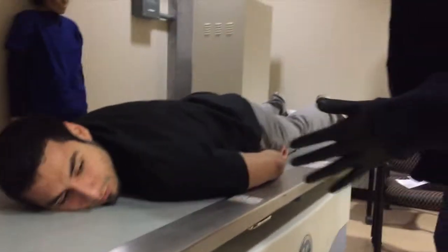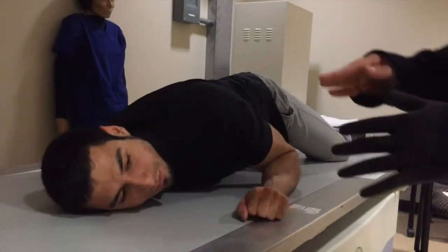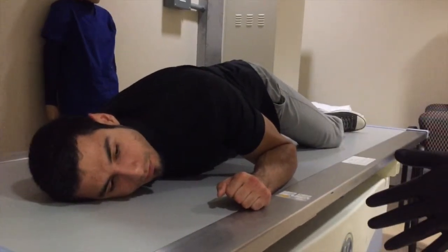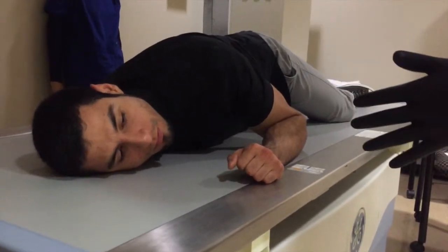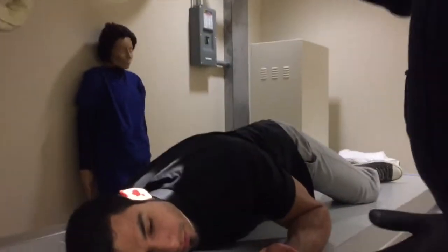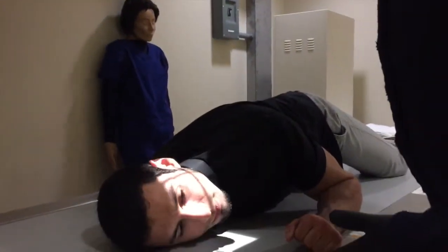Well, first thing you gotta do is put the head in a true lateral position. In order to do that, you can oblique the body as much as needed to obtain a true lateral. Now, a true lateral is when your mid-sagittal plane is parallel to the IR, and also when your IPL, your interpupillary line, is perpendicular to the IR. You also want to make sure that your CR is to the zygoma, which is the protuberance of the cheek.